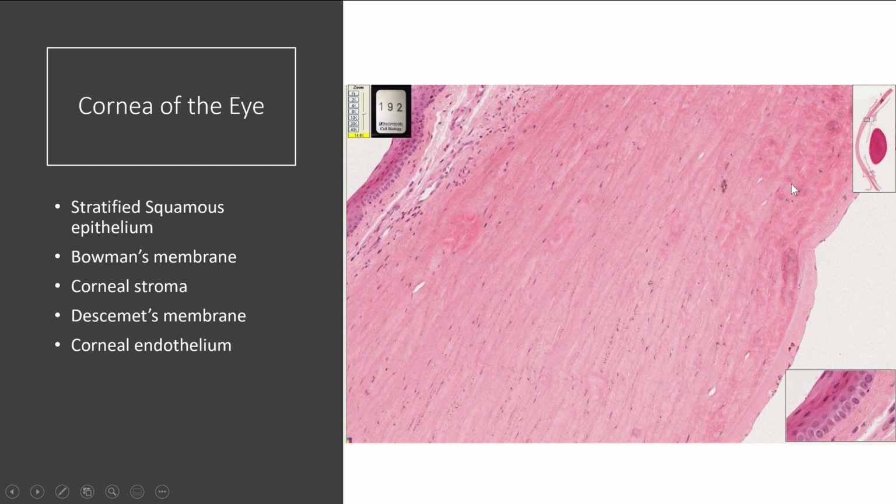So now we're looking at the cornea. If we zoom in on the cornea, so this is kind of the edge of the cornea, but remember this is that clear part of the eye that light does have to pass through. And so it's got these different layers, and so the outermost one, so this is the outside of the eye where the light's coming from and then passing through the cornea. The outside, remember, this part of your eye is open to friction, right? Every time you blink your eye, there's friction.